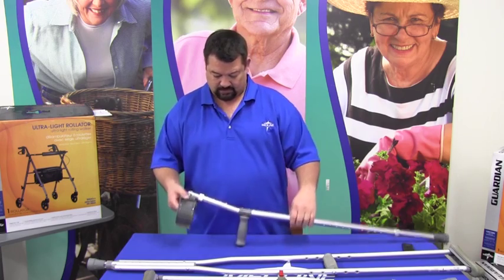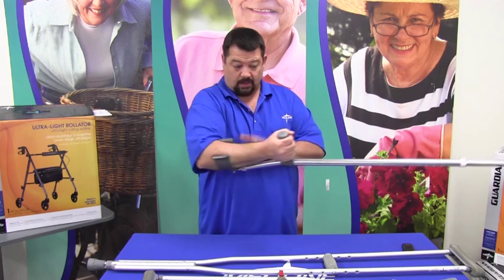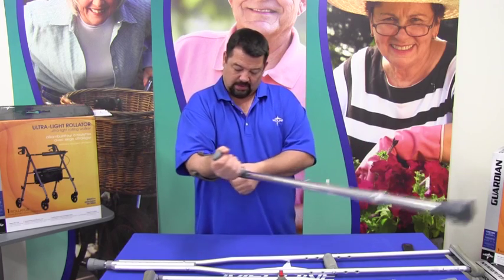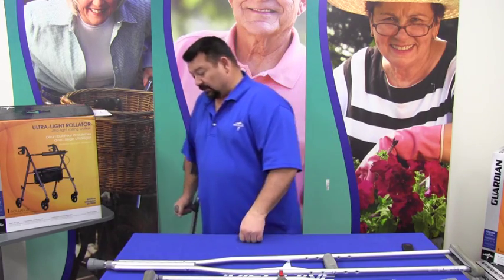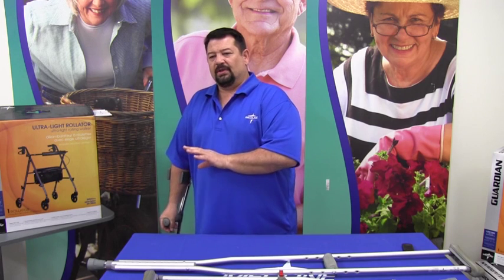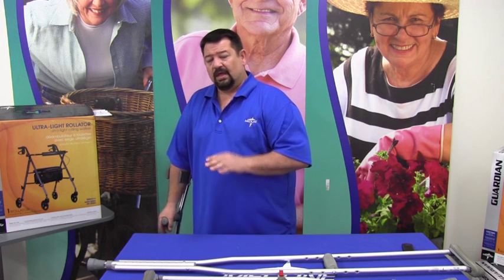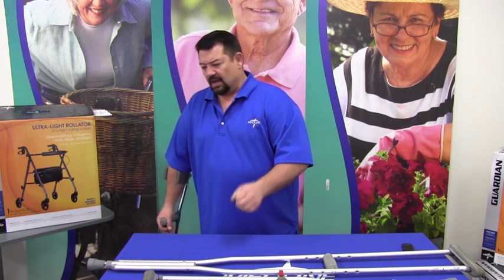Adjust it out. Make sure that everything seems to fit. Tighten it all back. And now have the person try it. Again, because these are designed for people who are going to be using crutches a long time, the familiarity is there, unless we're dealing with pediatrics.